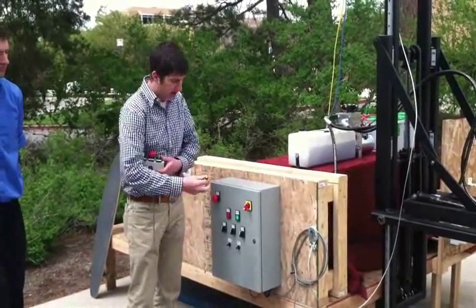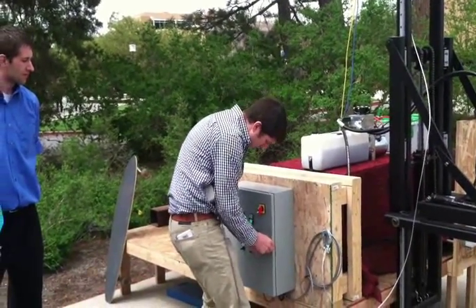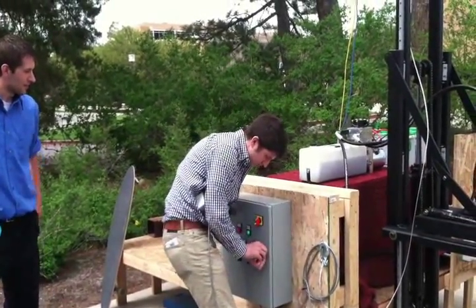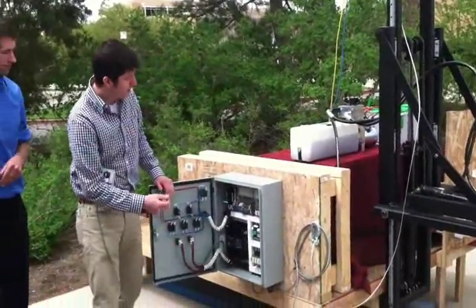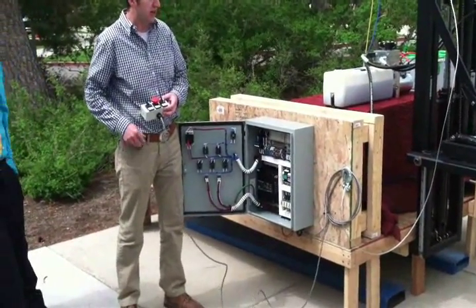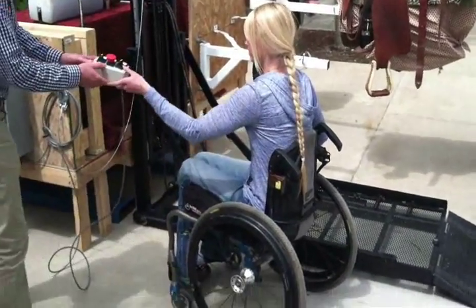Inside the box is our programmable logic controller. We decided to go with the PLC because it allows for much greater variability with our design.